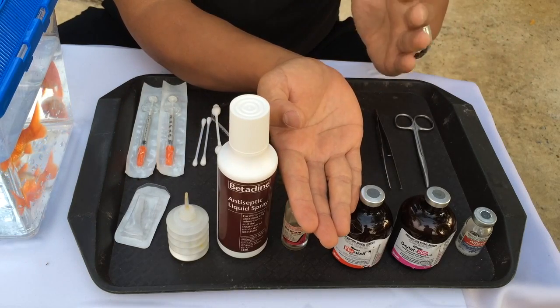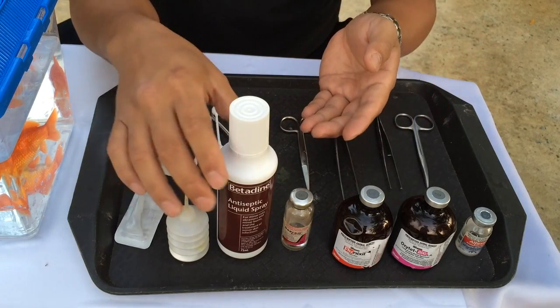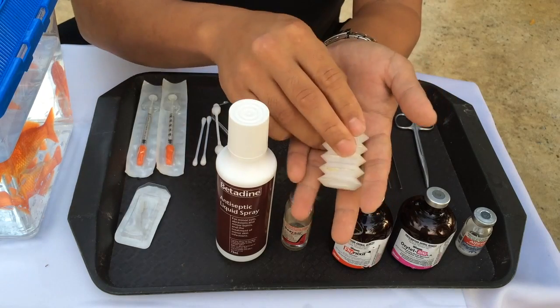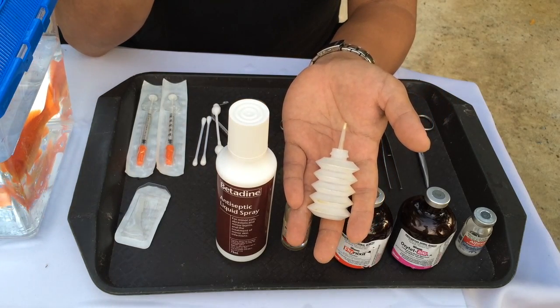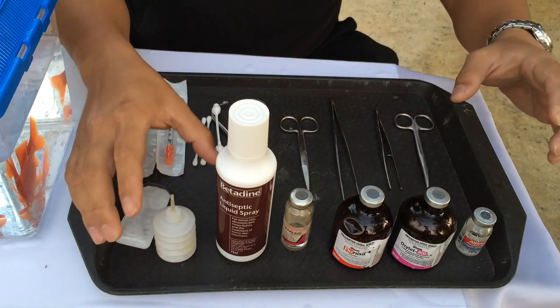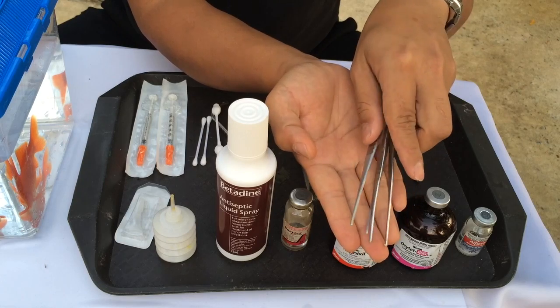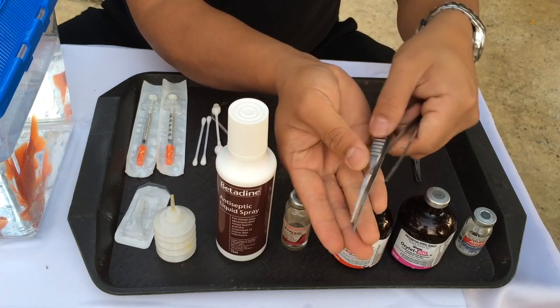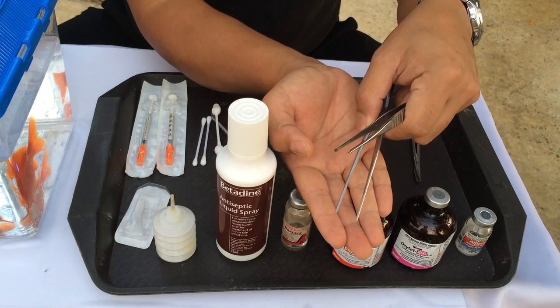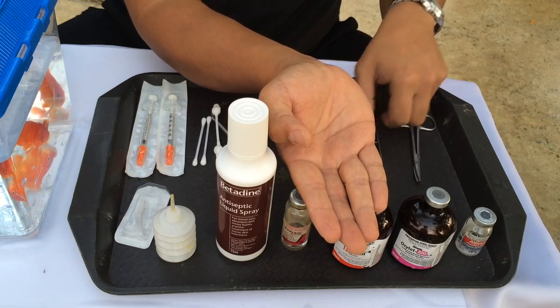We also need to apply some sort of a fish band-aid. We're going to use a combination of betadine, which is available through your pharmacy, and my version of fish bandage — it's a poloxamer powder which you'll see us apply. For equipment, we've got two kinds of forceps: rat-tooth forceps, and a very fine pair that helps you hold and manipulate tissues without causing too much trauma to the delicate structures.